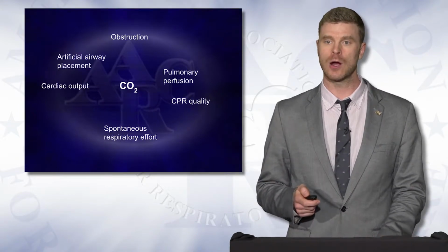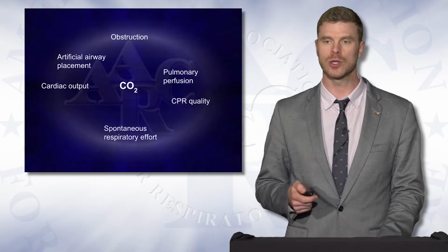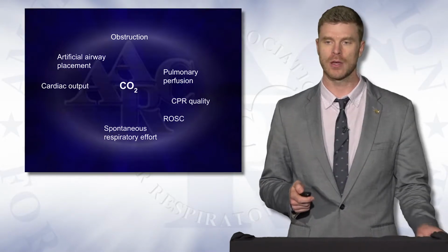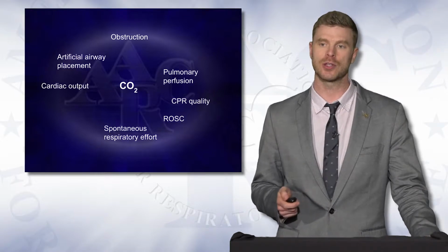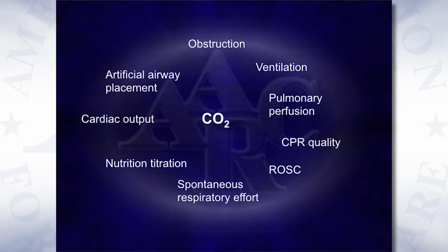artificial airway placement, verifying endotracheal tube placement, quality of CPR as well as return of spontaneous circulation, ventilation titration, as well as nutrition titration. As you can see, this is not a comprehensive list, but there's a lot of things on this slide that I think you can appreciate CO2 monitoring will play an important role in this patient population.